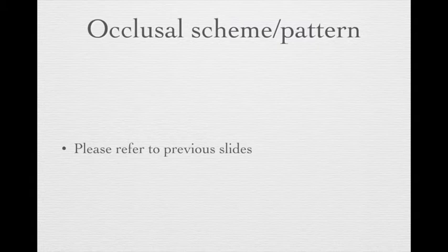After you finish your remounting on the articulator, you will start to do occlusal adjustments. Those occlusal adjustment principles follow the previous slide we talked about. Different occlusal schemes or patterns are provided to patients, depending on the scenario. After you finish the RPD adjustments, the RPD can be seated intraorally and has a good occlusal relationship to the opposing teeth. Now you are ready to deliver the RPD to the patient.